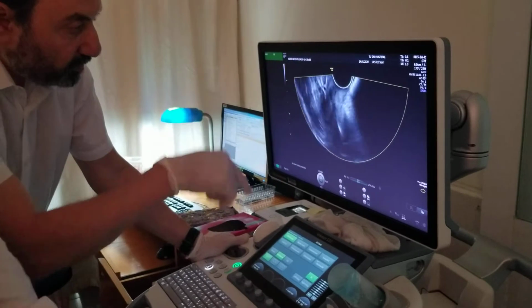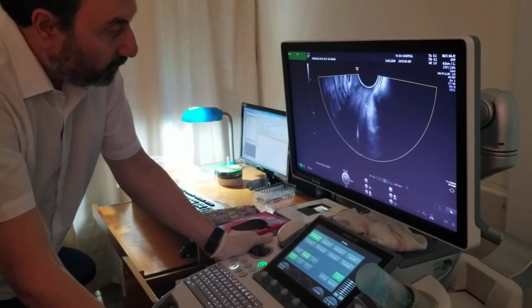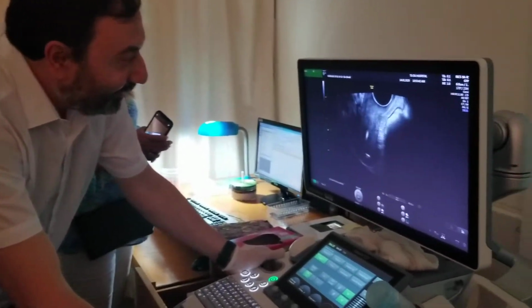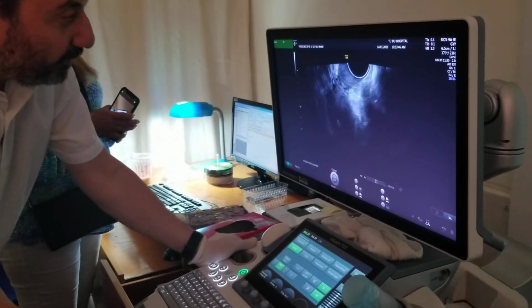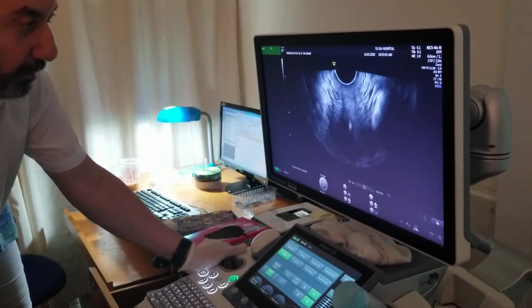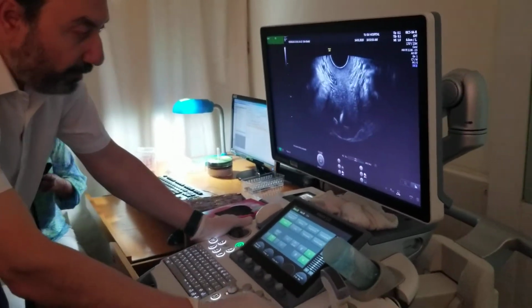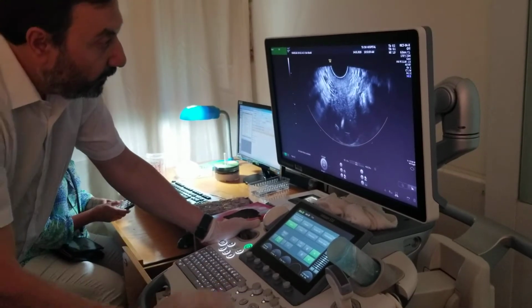Now the uterus is down. Are you retroverted? Okay, because the uterus was coming up, now it's going straight down. If not, we can go transverse. Let me try the volume here first, then we go to another patient. I think she should be okay.